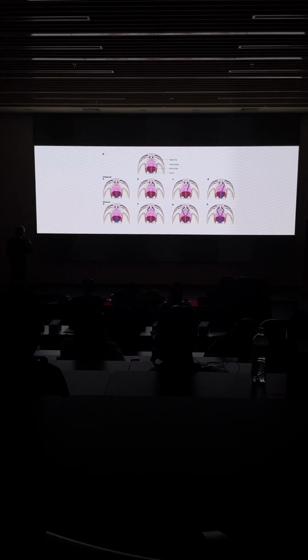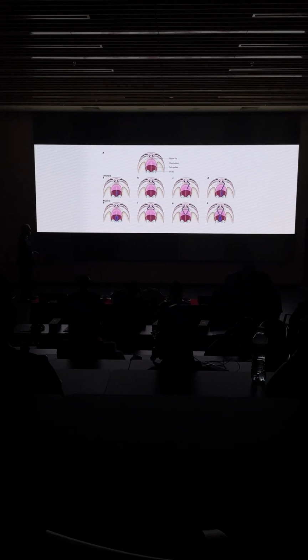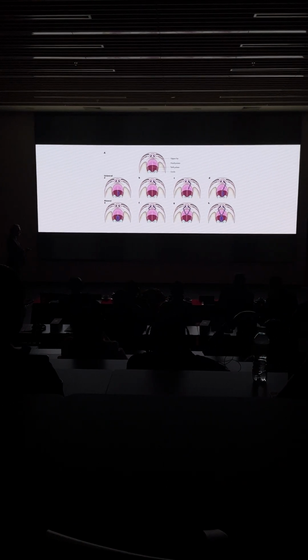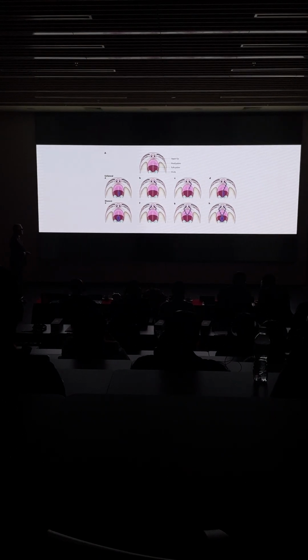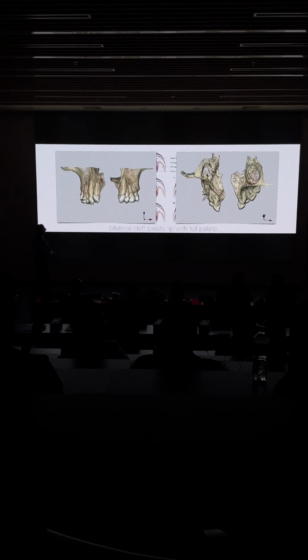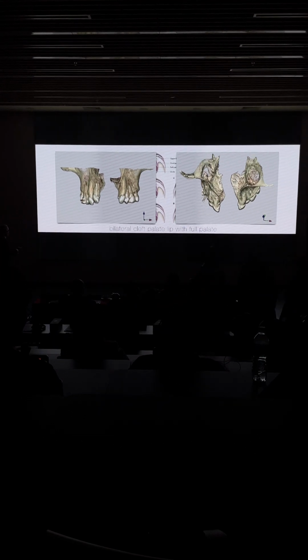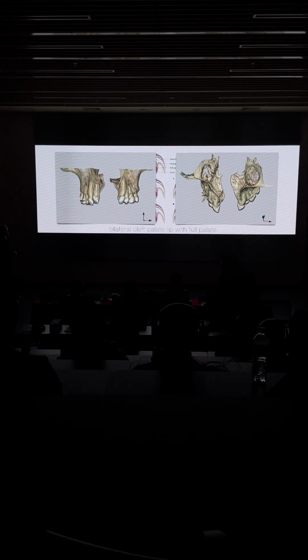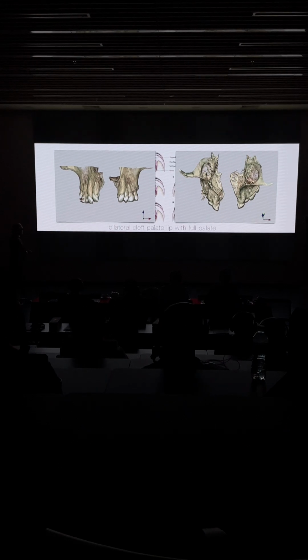You can see all the classifications of the different cleft palates, and she's the worst. She has a bilateral cleft palate with involvement of the palatal aspect. Okay? This is what she looks like on the CBCT. You can see here, this is a canine. This is a lateral incisor, canine. And you can see the involvement on her palate.